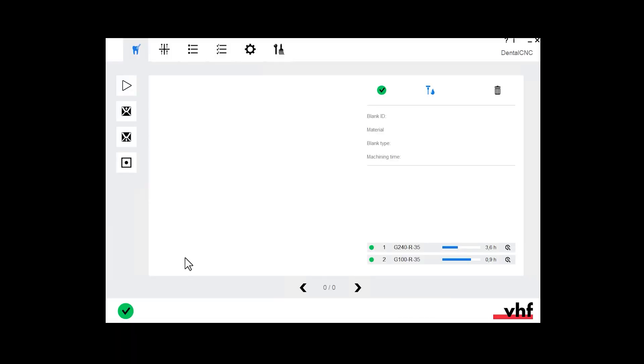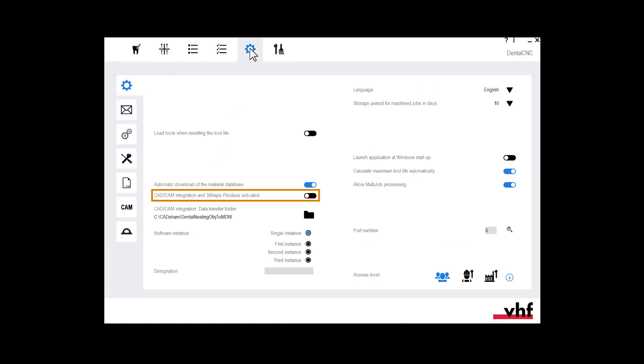Switch to DENTALCNC. Open the general application settings. Activate the following option: CAD CAM integration and 3 shape produce activated. Never close DENTALCNC as it is required for the machine to function.